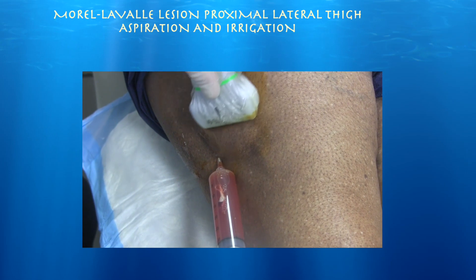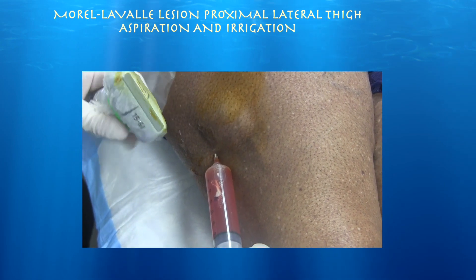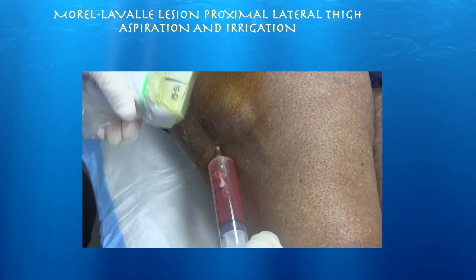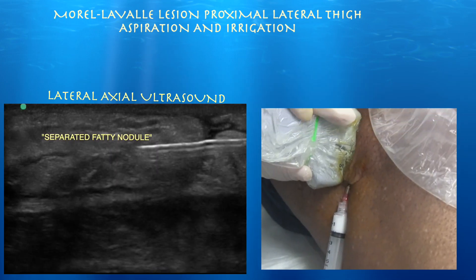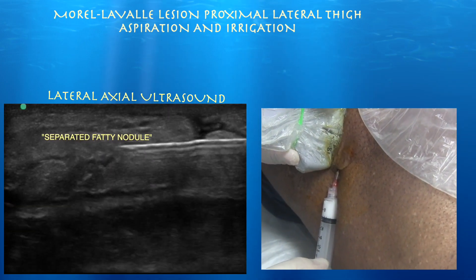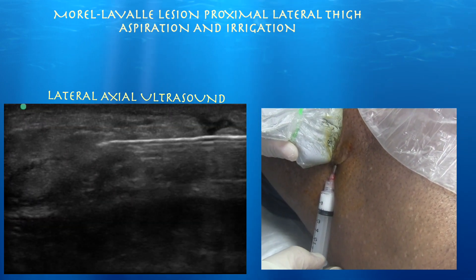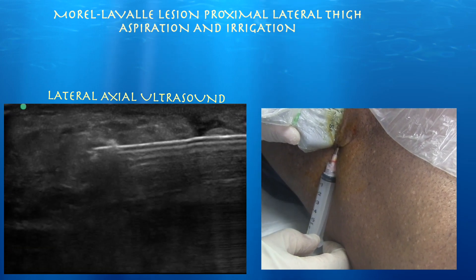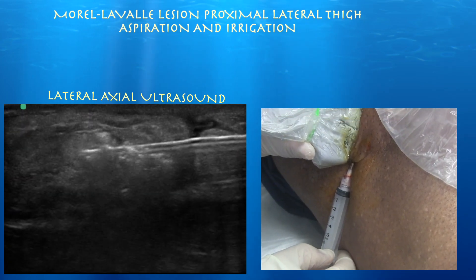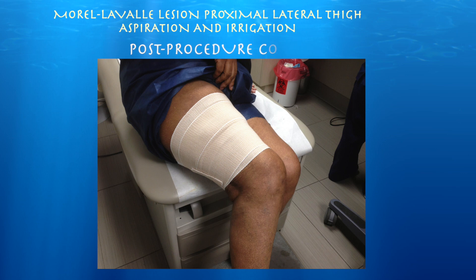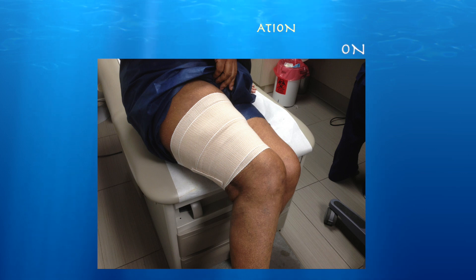We injected cortisone directly into the fatty nodule, using the atrophic side effect of cortisone to hopefully shrink it. You can see the cortisone filling up the nodule. Upon follow-up, unfortunately the cortisone did not have an effect on shrinking the fatty nodule, and therefore she was referred to surgery for removal. However, the Morel-Lavallée lesion itself essentially did not recur.